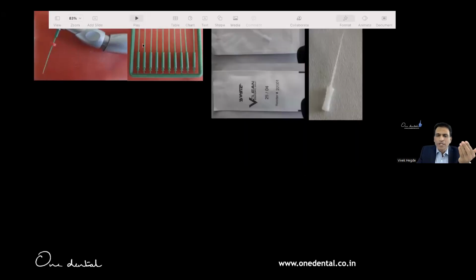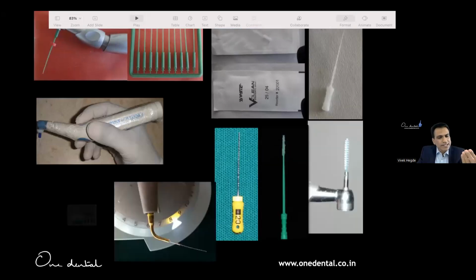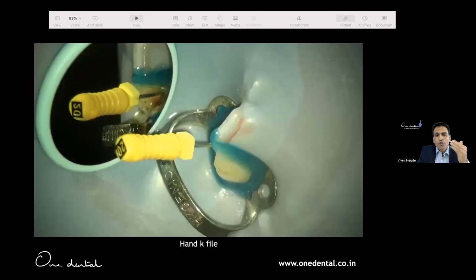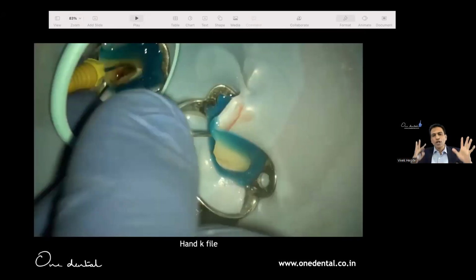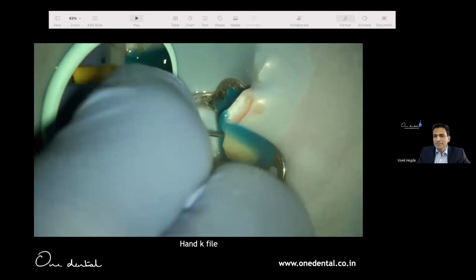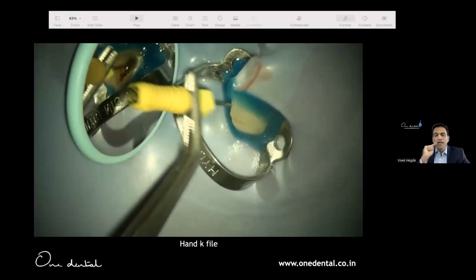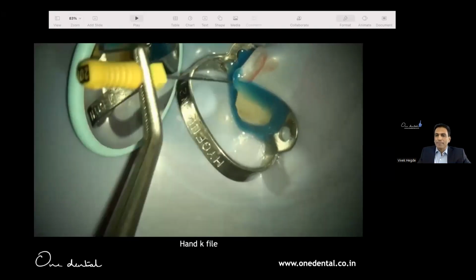And then you have plenty of activating things. So you need to activate and irrigate, in combination with hand, with rotary, with sonic, with ultrasonic, with lasers, or any one of these. So here are a few examples. I will only say in a joking way to my students, my participants, I ask them, how much money do you have? If you don't have a lot of money, don't go with all the gadgets. Manual dynamic activation is what I'm showing you. You can actually even do this. Nothing wrong. But be careful that you're not hitting the apex or the apical third as much, because I don't want post-op trauma.